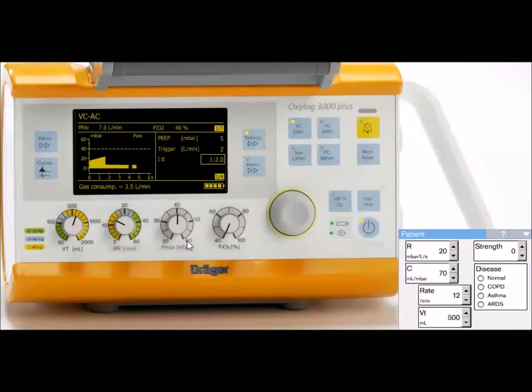And we can look at the monitor values here, the waveforms, and as you notice this dashed line here, this is actually my Pmax setting, and I'm just going to turn this down a little to 30 for my scenarios, and you can see I brought the pressure down to 30.